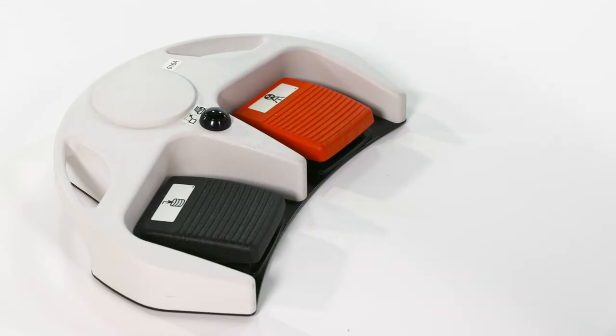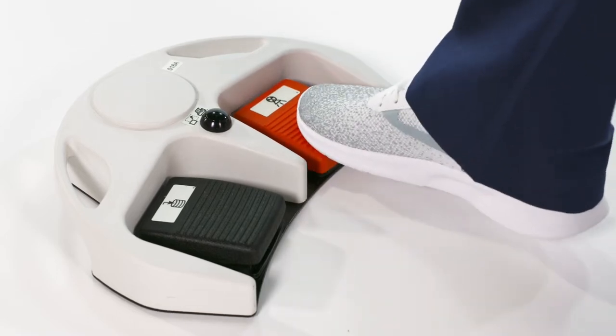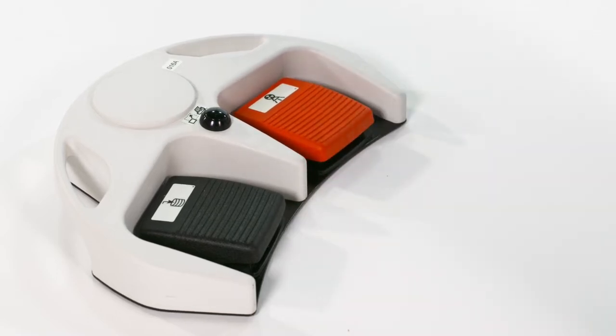The foot switch can be used to perform these functions. The black pedal is used to save images. The orange pedal is to take the X-ray. The black button in the middle is used to print the image.